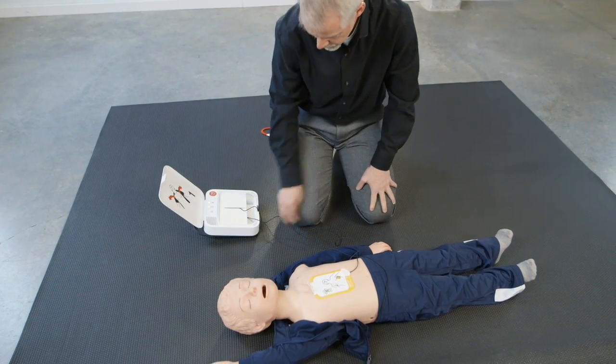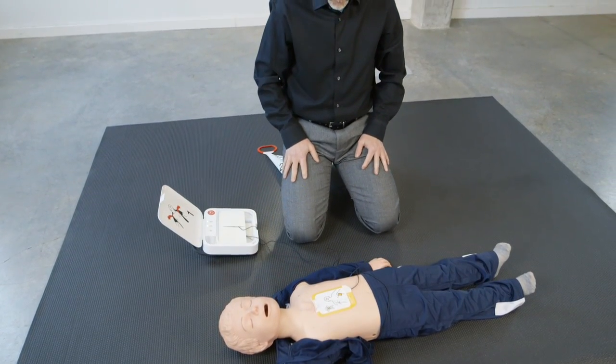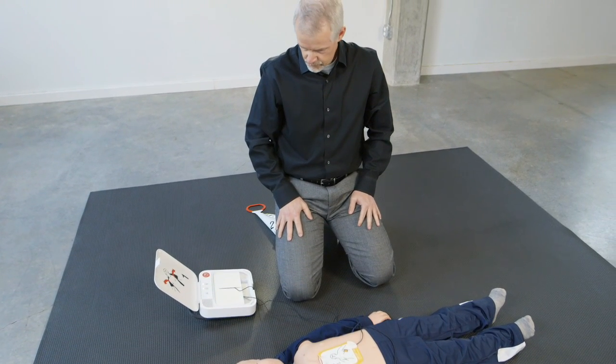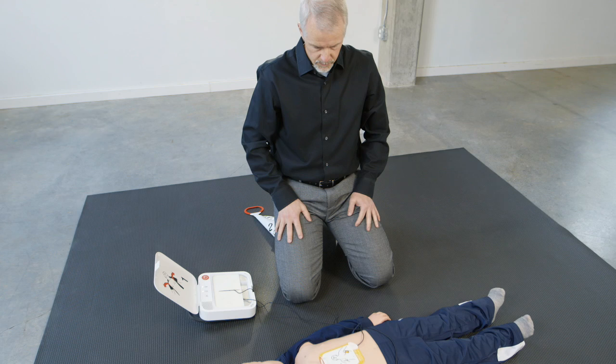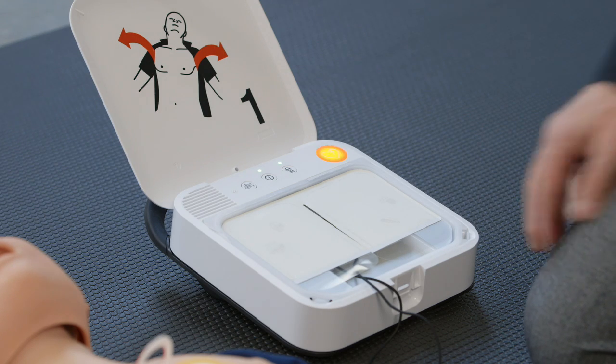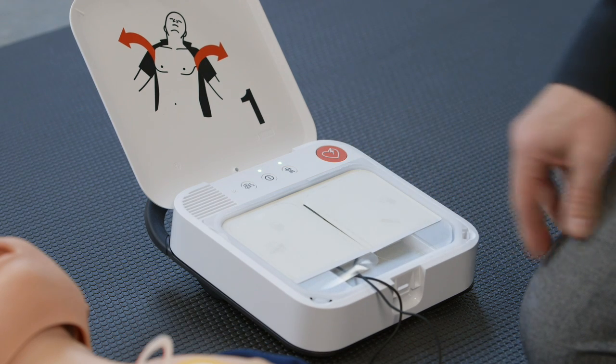Do not touch patient. Analyzing heart rhythm. Everyone clear. Press flashing button. Shock delivered.